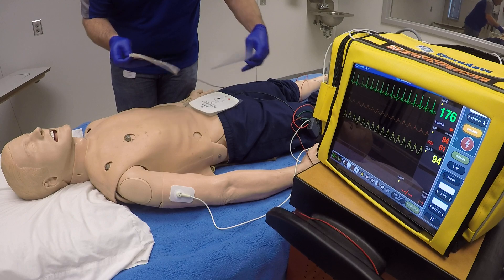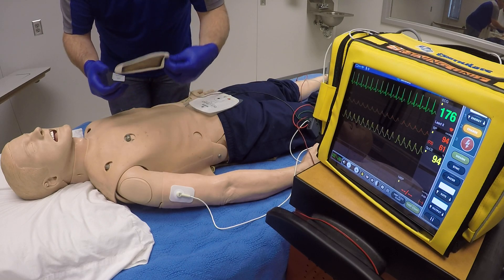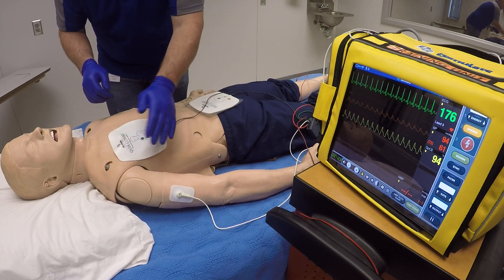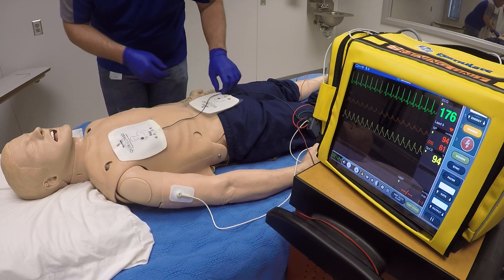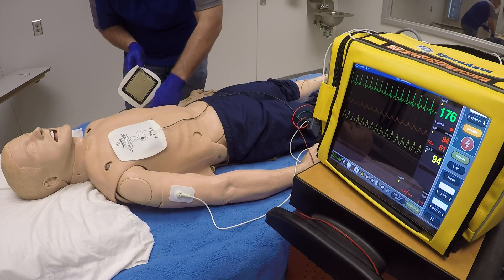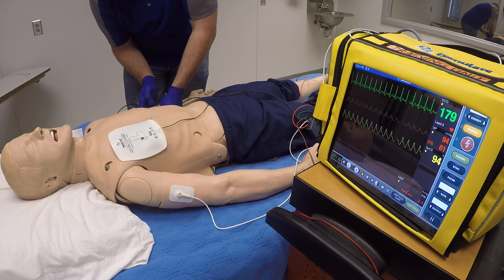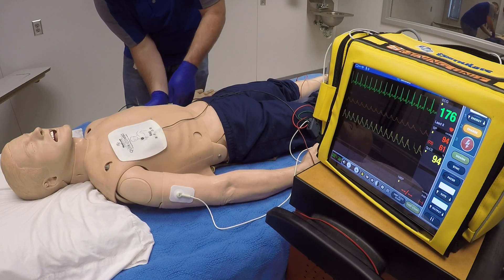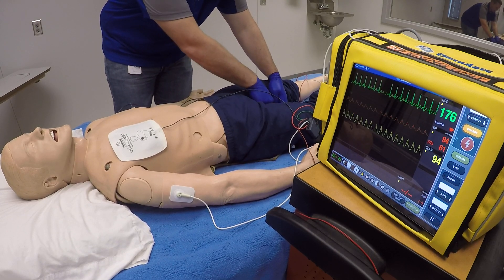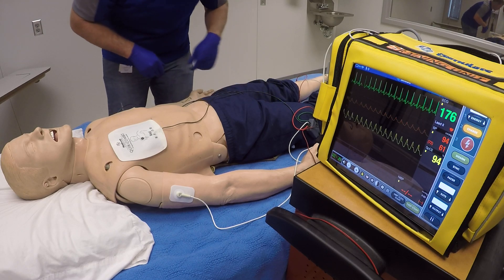This pad will go over the right side of the chest. You want to avoid any pacemakers or implanted defibrillators. This one will go on the left side, mid-axillary, just underneath the armpit there. Then hook that up and make sure you're connected to your defibrillation machine.